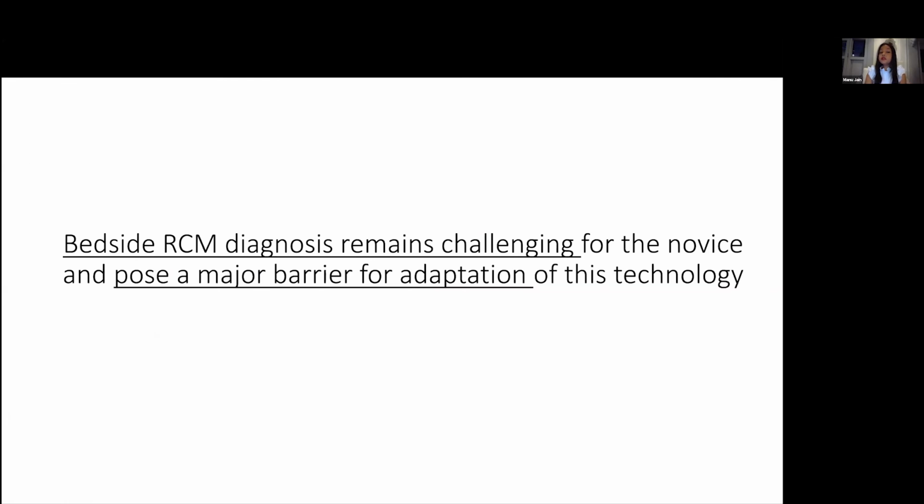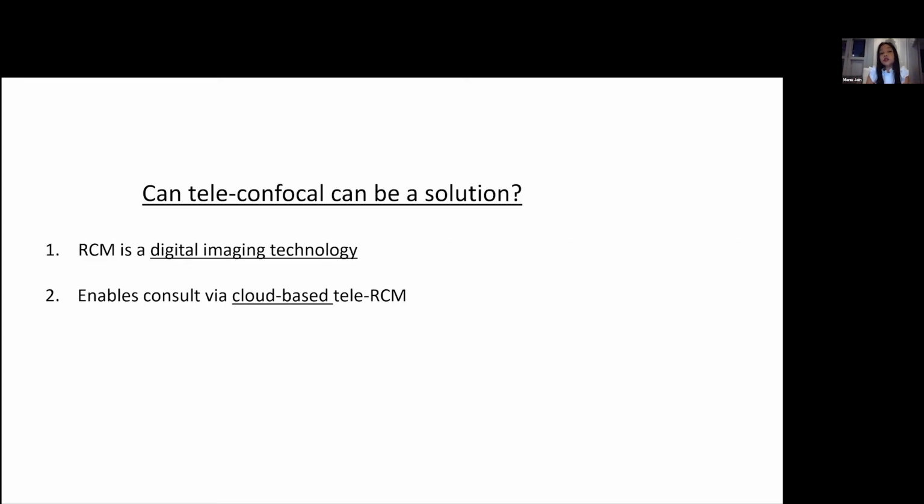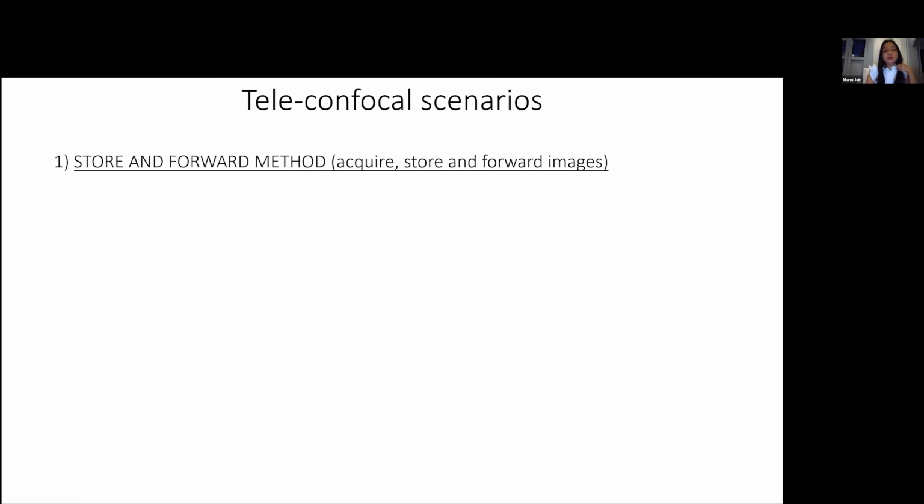Bedside diagnosis is a bit challenging because, as you saw, these images are black and white. It's a new technology, with very few experts currently able to read these images. But what is the role of teleconfocal? RCM is a digital technology, right? We are taking images digitally, and so they can be shared. And you can send it through the cloud, or even see what we do, our approach.